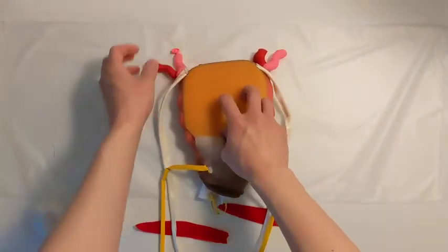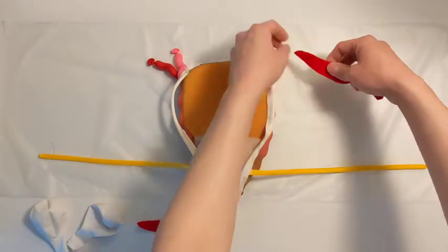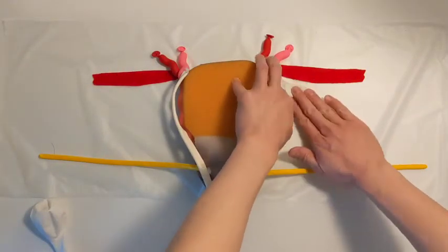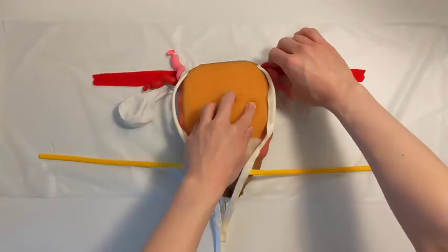Next, wrap the entire model in press-and-seal. Lay out a large piece of press-and-seal longer than the width of the model with the ureters fully laid out laterally. The sticky side of the press-and-seal should be facing you. Place the model on the press-and-seal, followed by the fallopian tubes and ovaries. Adjust the utero-ovarian vessels so that they are pointing towards the ovaries. Adjust the ureters and round ligaments as needed so that the round ligaments lay over the ureters.